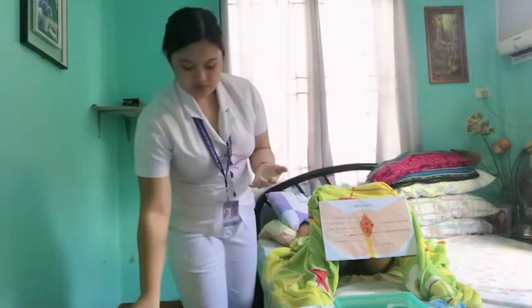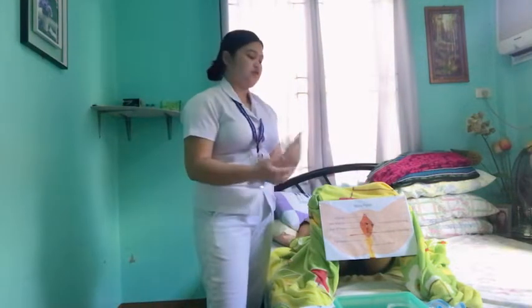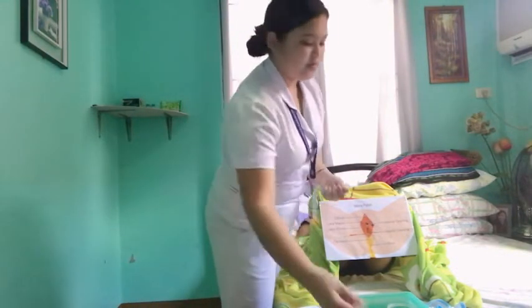So I have already opened the set and observed sterile technique. So what I'm going to do is to put on my sterile gloves in order to prevent contamination and to maintain the sterility of the set.